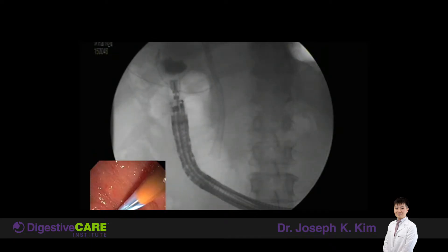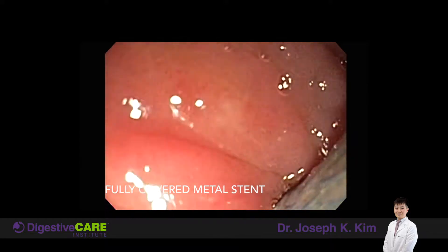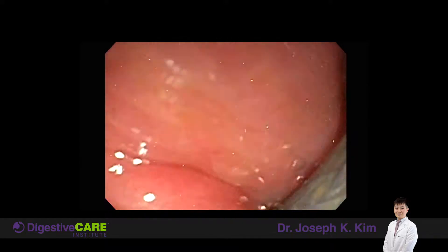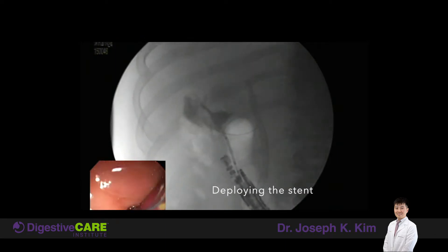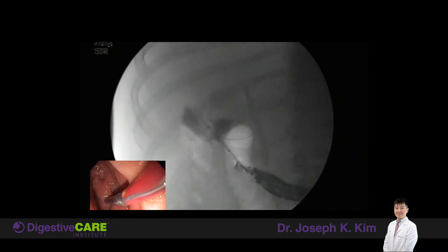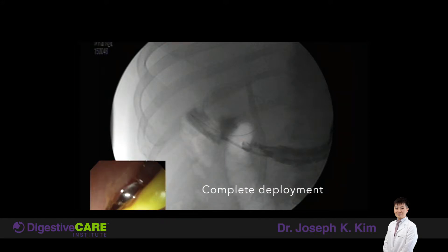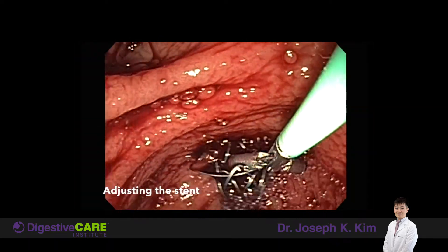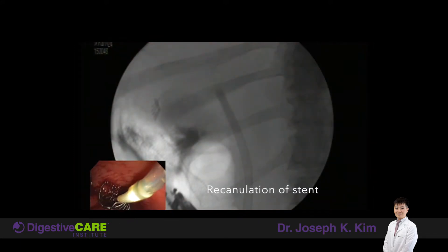Once we confirm that placement, we are deploying a fully covered metal stent. This metal stent is made out of nitinol. It is covered so that there can be no ingrowth of tissue. We're deploying this using fluoroscopic x-ray imaging along with the endoscopic view, which you see in the left lower quadrant. This is successful deployment, and once it's deployed, you see that there is a flash of bile that comes out — that's successful placement.